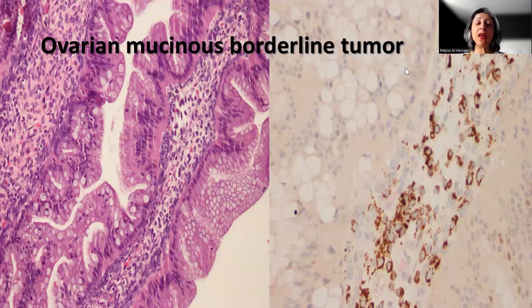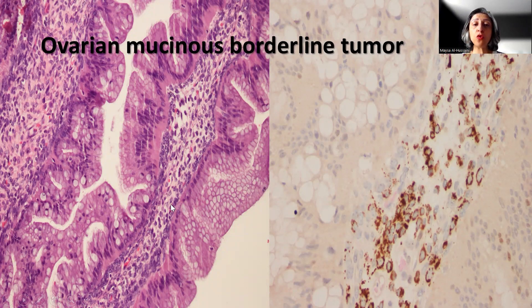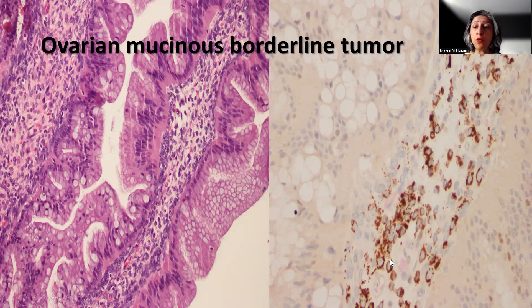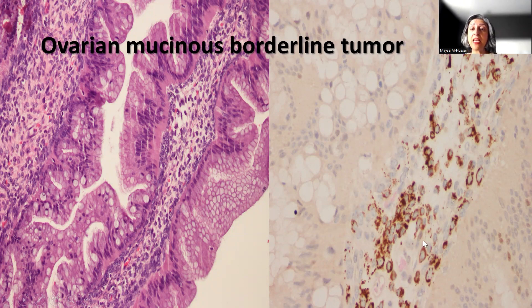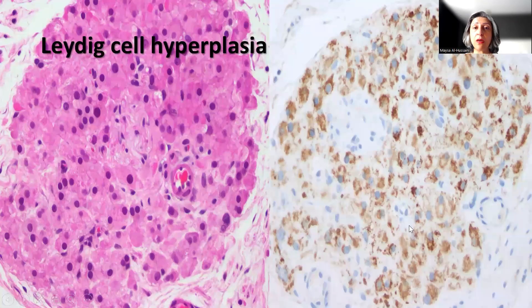This is a very nice case of ovarian mucinous borderline tumor. As we all know, the stromal cells sometimes become luteinized within the stroma of borderline mucinous tumors. SATB2 is actually beautifully positive, showing granular cytoplasmic staining in those luteinized cells.